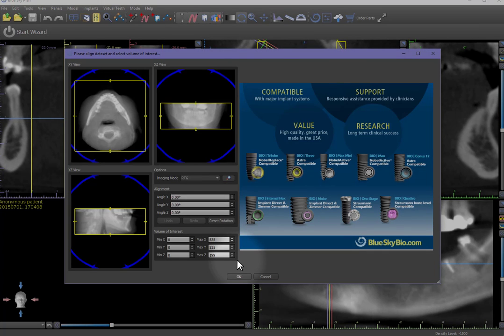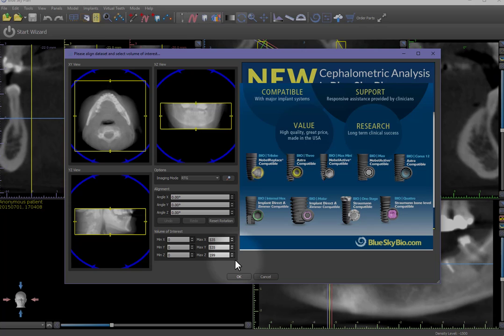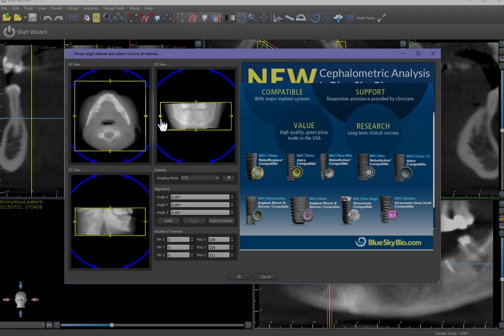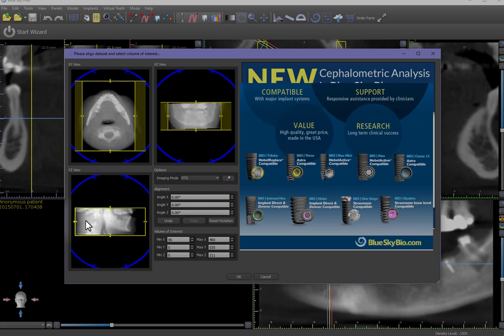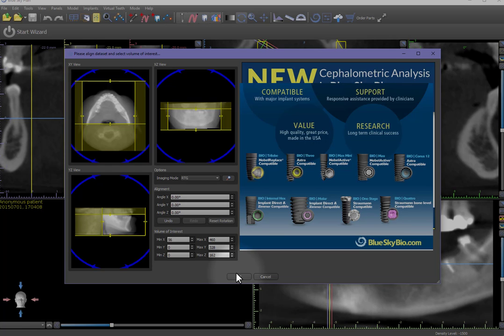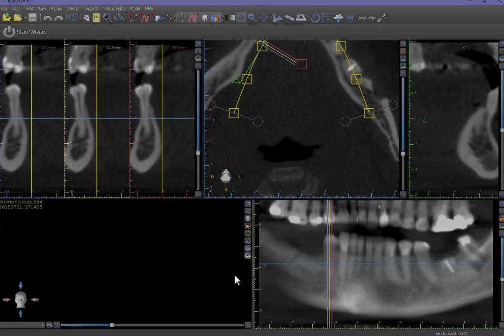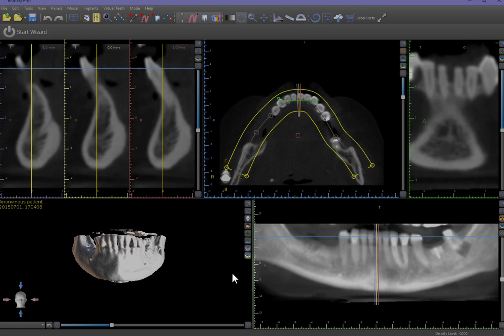The Align Data Set and Set Volume of Interest window appears after loading the DICOM series. Left-drag on the outer rotational controls to set the patient angle as necessary. Left-drag on the arrows of the cropping wipers in any of the orientation views to expose only the arch of interest. This focuses solely on this area, which will result in all the views in Blue Sky Plan displaying the images larger than if shared with an opposing arch.